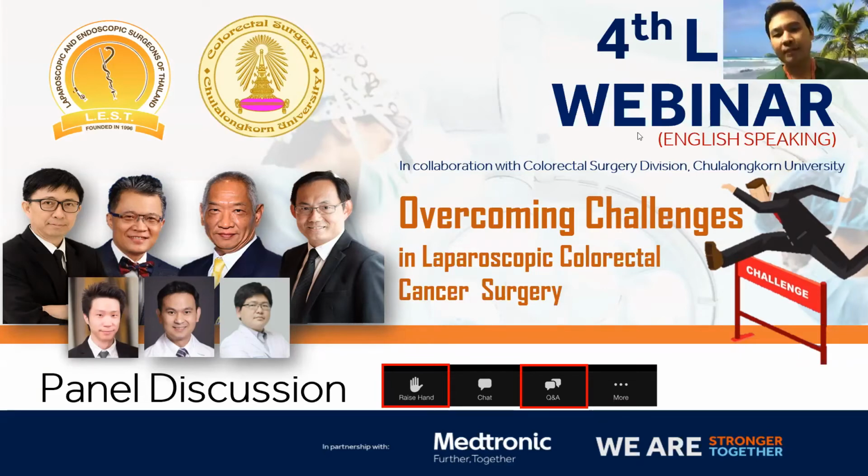And then I think we already published that paper 2 months ago. We used the ICG to identify the nodes and also the vascular structures because we were going to do the D3 dissection for that case too. For the routine use of ICG, I don't agree with that. But however, after that scenario, maybe there are some roles of the ICG in some particular cases. If that can answer your question.